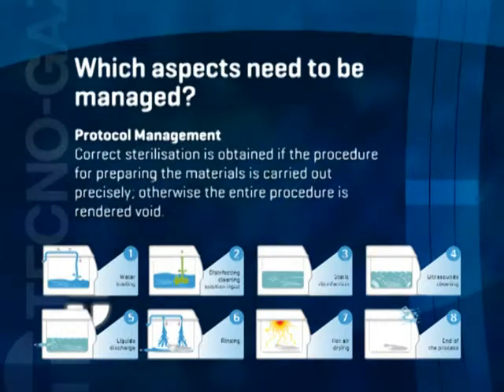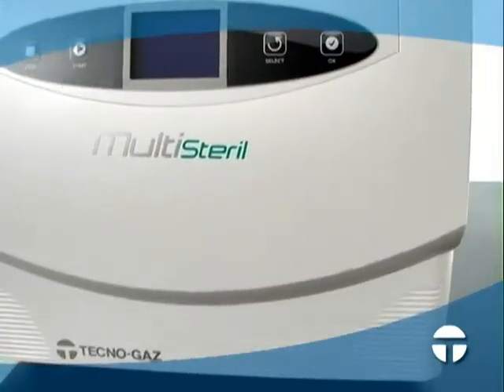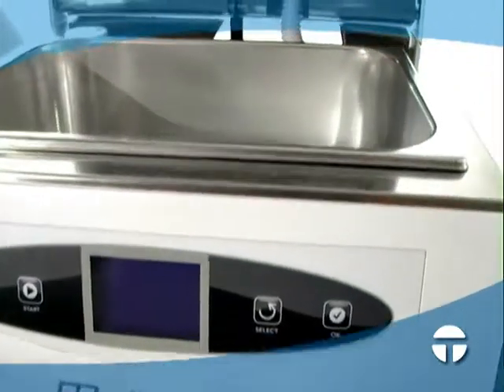Protocol management. Correct sterilization is obtained if the procedure for preparing the materials is carried out precisely. Otherwise, the entire procedure is rendered void. Multisteril is able to guarantee that the whole protocol is performed with absolute precision, in conformance with the reference protocols, guaranteeing a perfect preparation procedure before sterilization.